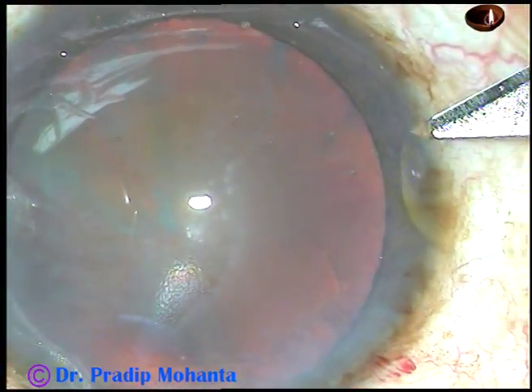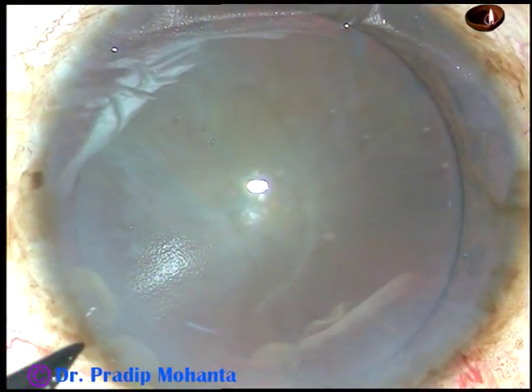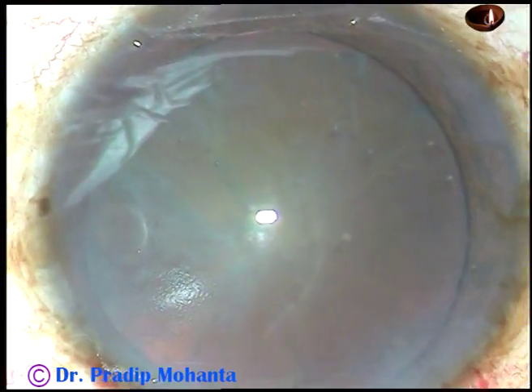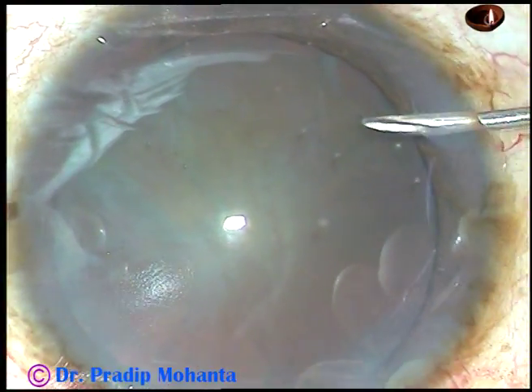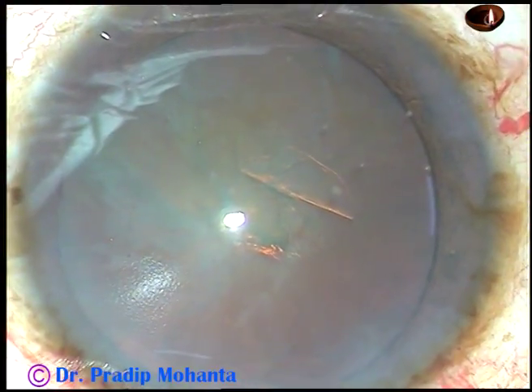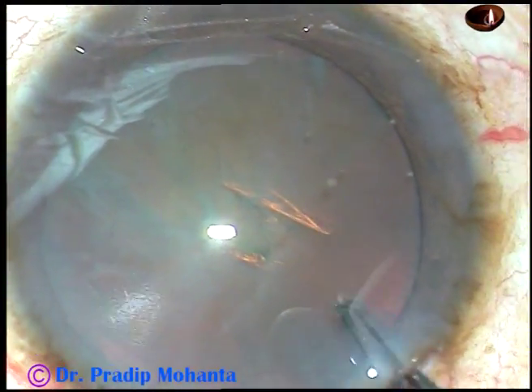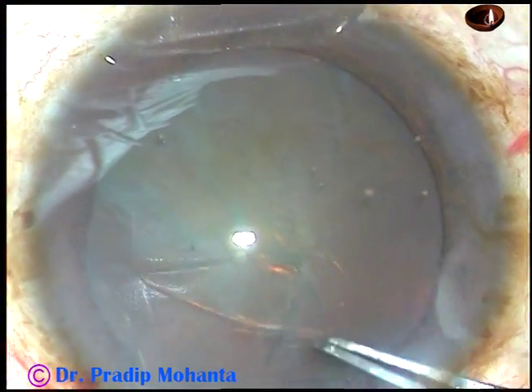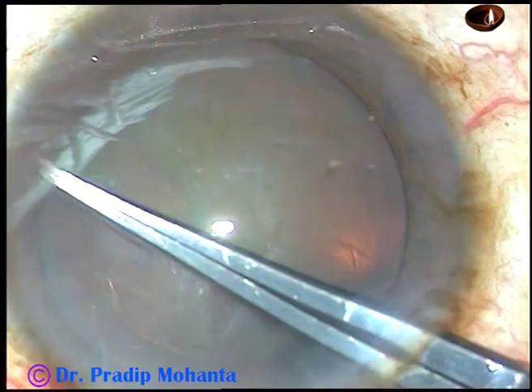Two side ports, one on the right side and another one on the left side, are made. Now capsulorhexis is to be done. A 26 gauge bent needle is introduced through the right side port. The anterior capsule is incised and a nice flap is raised. I take a utrata forceps, lift the anterior lip of the main incision, hold the flap, go anti-clockwise, remaining at a certain distance away from the margin of the pupil, and thus create a round rhexis.